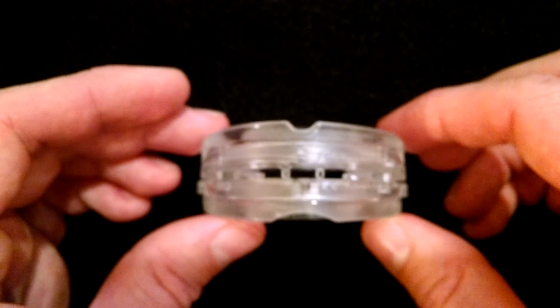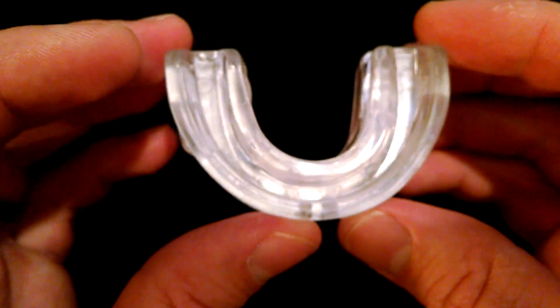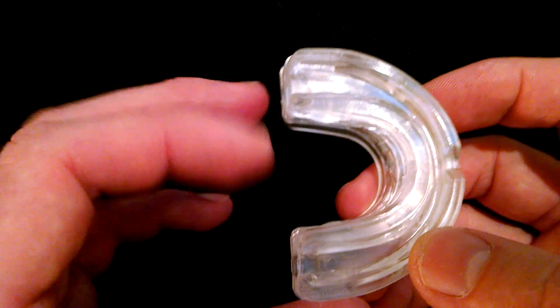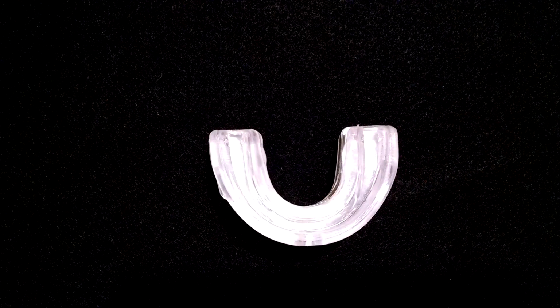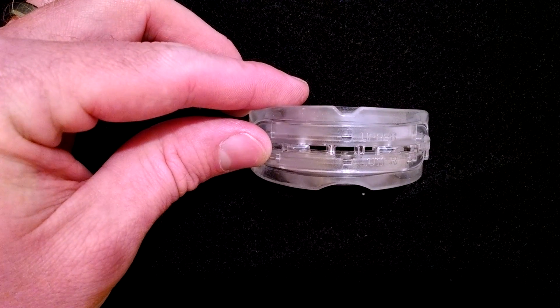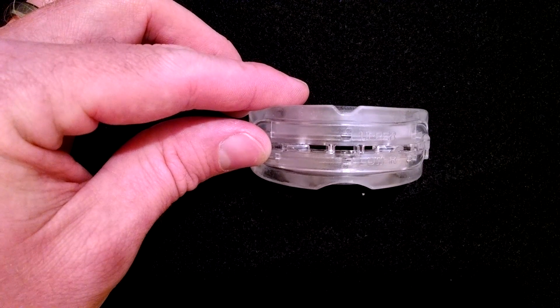I've actually fitted one of these a few weeks ago. I tried this thing out. This is a fresh mouthpiece, so this is what it's going to look like whenever you get it in the mail, but before you use it you must create a custom impression. The way this is done, you basically take a pot of water, boil it, remove it from the heat source, and then drop this mouthpiece in for 90 seconds. At the end of 90 seconds, you remove it with a pair of tongs, give it a quick dip into cold water, place it inside your mouth and bite down for 30 seconds.